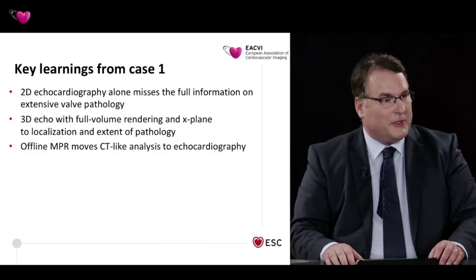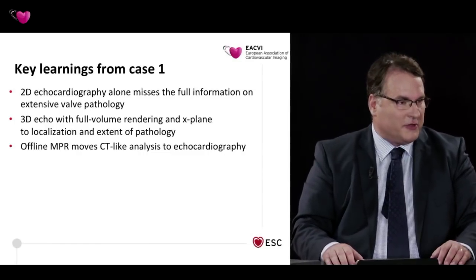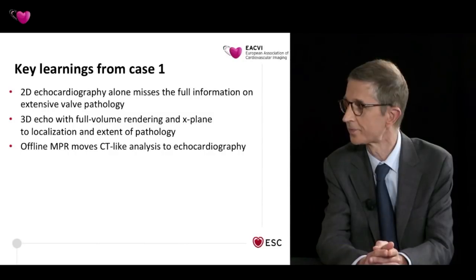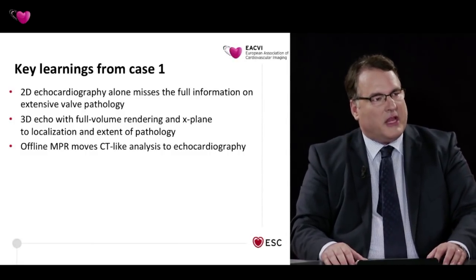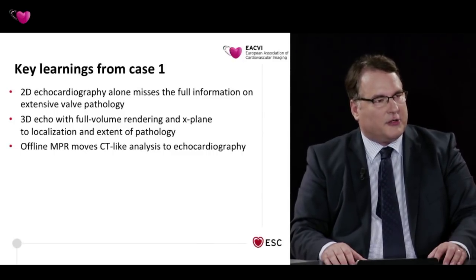multi-planar imaging. And I was also surprised to see that the commissural view in the sample that you gave was actually at 80 degrees, which is not the normal area where we look. So normally we start with 60 degrees, but it also shows that hearts with pathologies may have rotations that leave the usual patterns of standard 2D views.